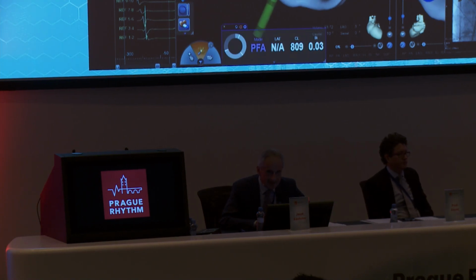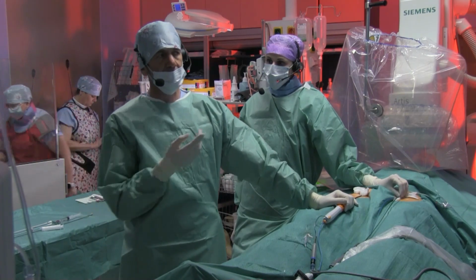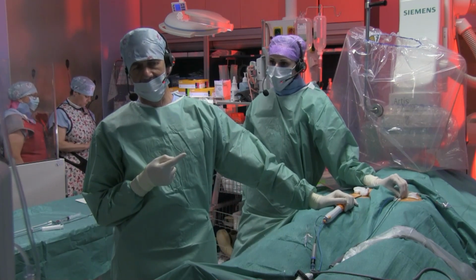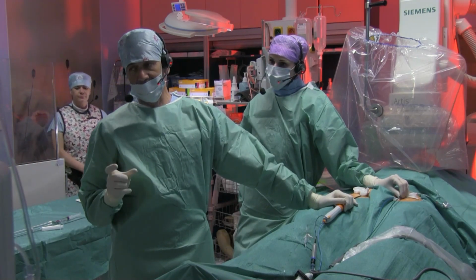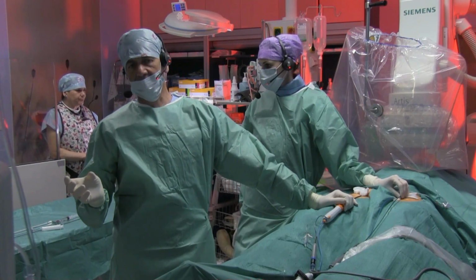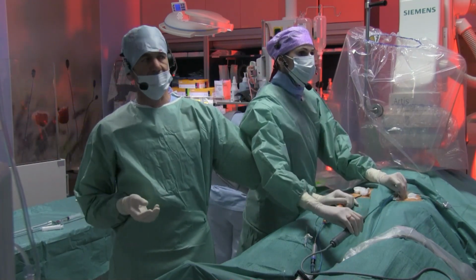What I do, I don't do the right side, I do only, in the left, the roof of the left superior and under the roof of the right superior. We don't increase so much, and this is good for patients that also have pauses at AF interruption. Of course, if you have a healthy man with 50 beats per minute because he is a runner, of course we don't. Of course, you are right.